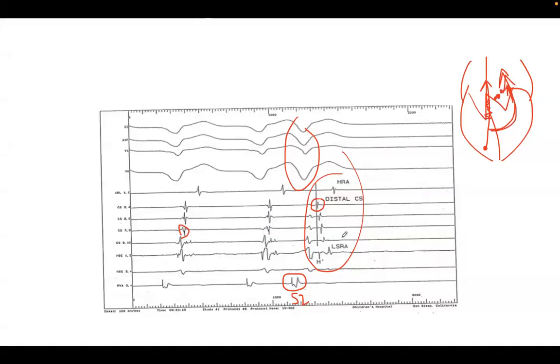And this is how you should map the patients. You want the least amount of fusion possible, hence during SVT or during short coupling PVCs, such that your AV node either blocks or conducts retrograde very slowly.